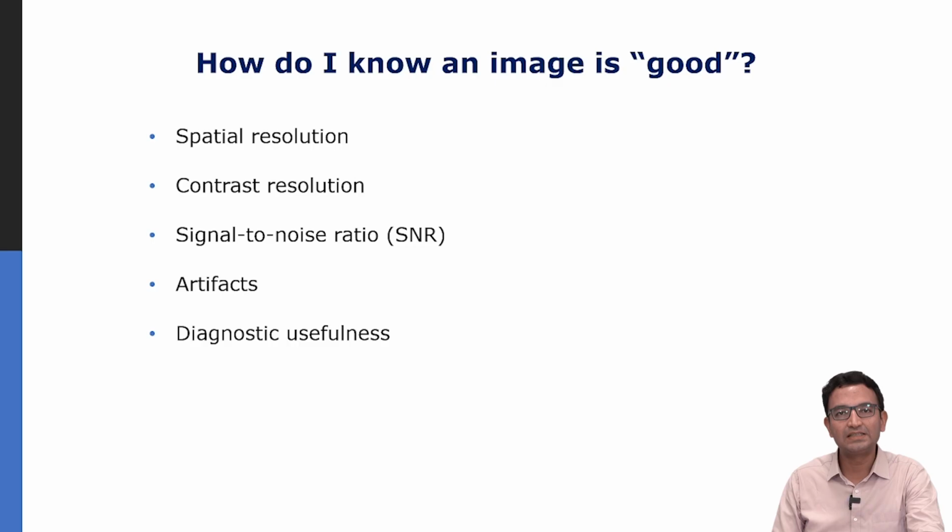So today let's discuss the quality of ultrasound images. How would I know if an ultrasound image is good? We would definitely need some metrics, right? So some of the metrics are spatial resolution, contrast resolution, signal to noise ratio, presence or absence of artifacts, and the overall diagnostic usefulness of an image.